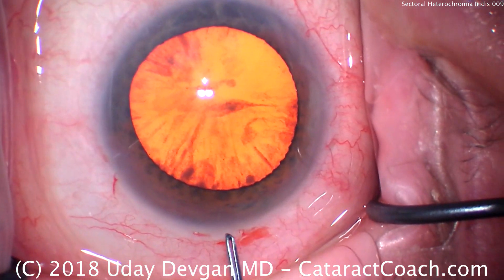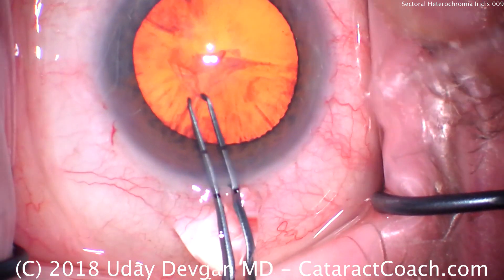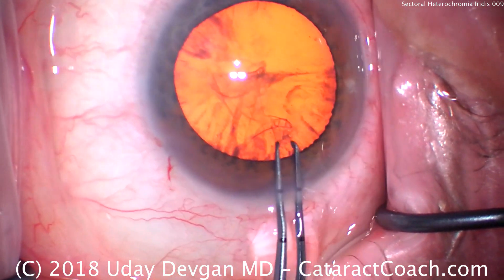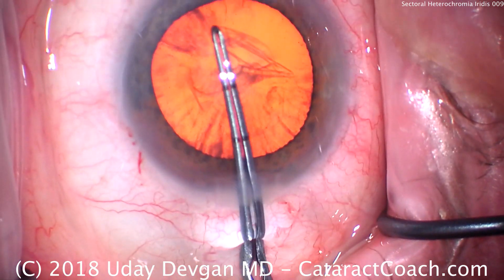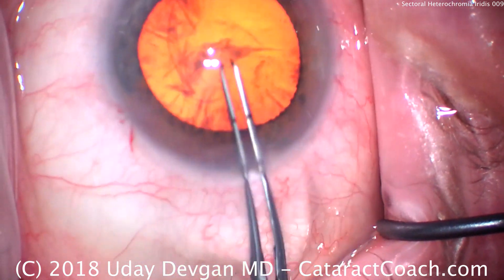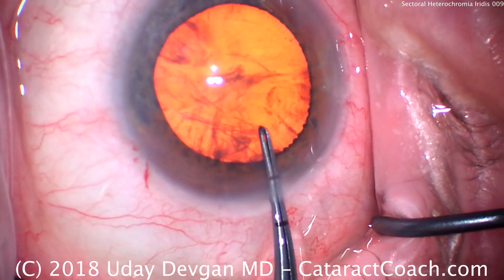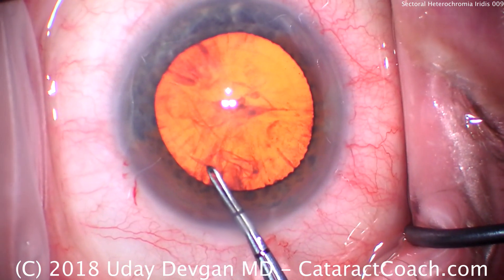To do the capsulorhexis, we want to aim for about a 5mm, maybe 5.5mm capsulorhexis. We use the forceps to pinch and grab, so we don't need the cystotome. We'll do our round rhexis here. Note that we float in the incision in order to not deflate the AC — we don't want to lose viscoelastic. Take your time, especially at the last step, to make it as pretty and round as possible.